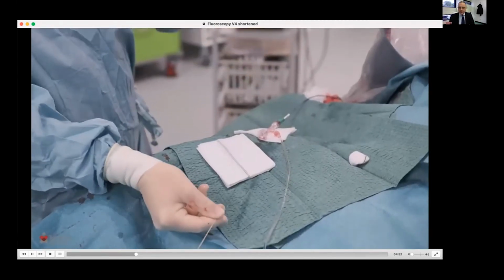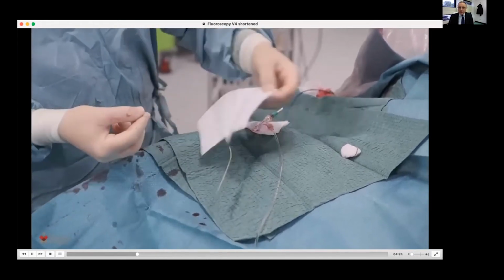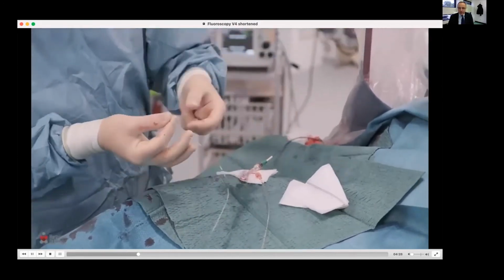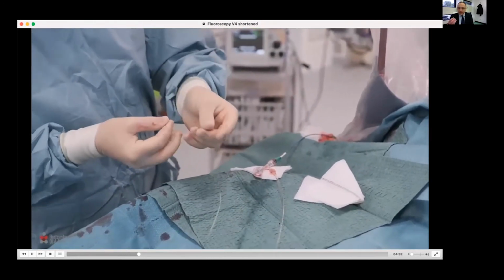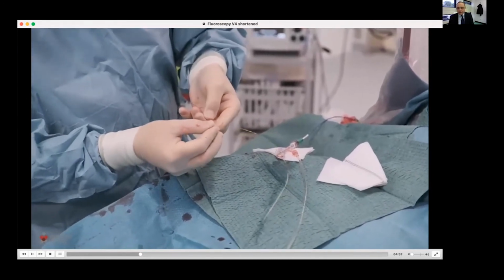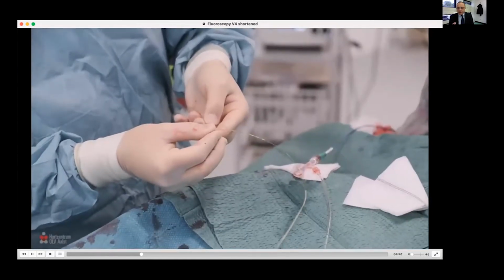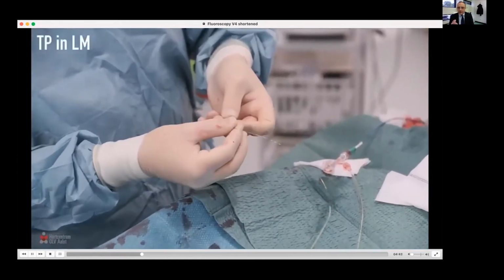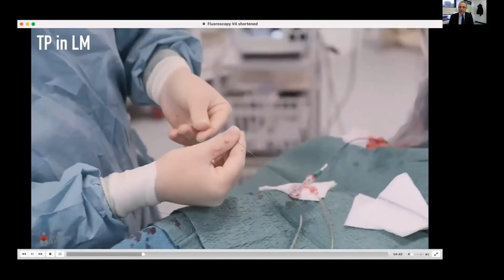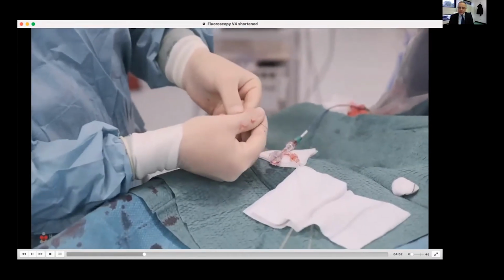You know, it has a short monorail that you can appreciate now that I'm loading the microcatheter on the guide wire. Let's follow this step. You know, it's a very tiny microcatheter. As Luigi was alluding to before during the presentation, this is really a good profile. It's so thin that nearly mimics the tip of a guide wire. And that is why I suspect this microcatheter can really advance and slide everywhere without any kind of problems.